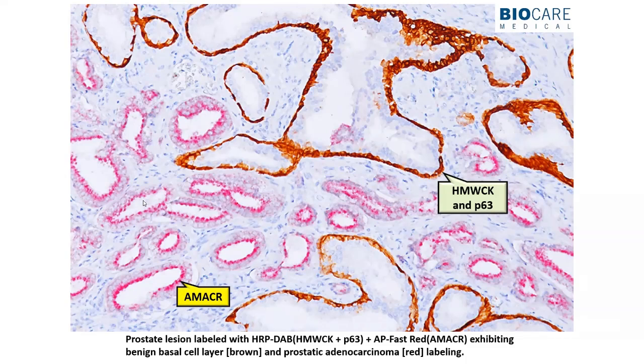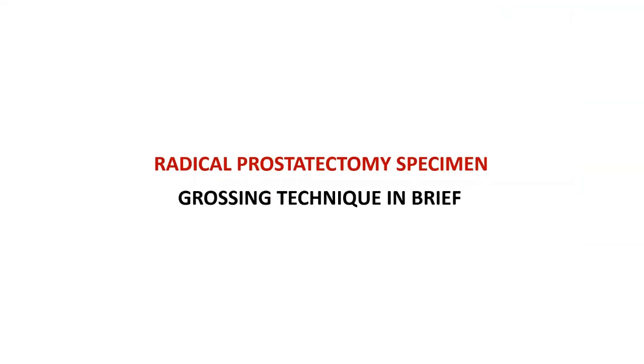So you have got these atypical red positive, brown negative glands, which are infiltrating through the brown positive and red negative benign glands of the prostate. You achieve 2 things at the same time. You achieve the diagnostic certainty that these atypical glands are expressing AMACR, and you can also establish the fact that there is an absence of the basal cell markers.